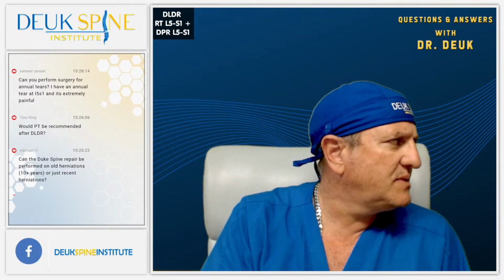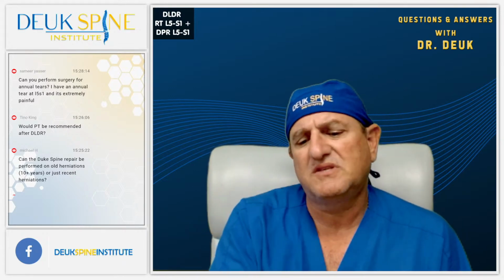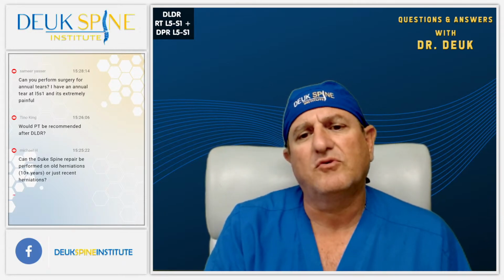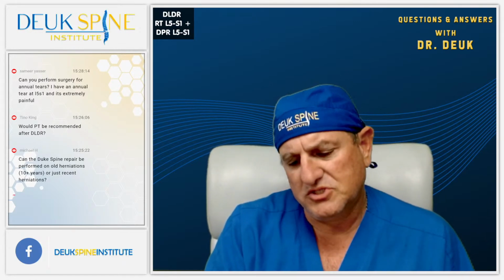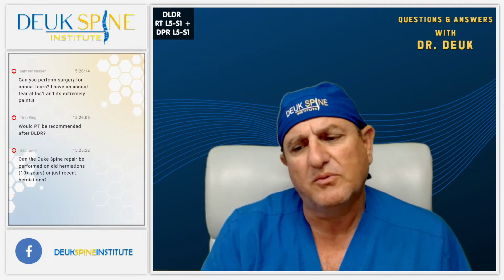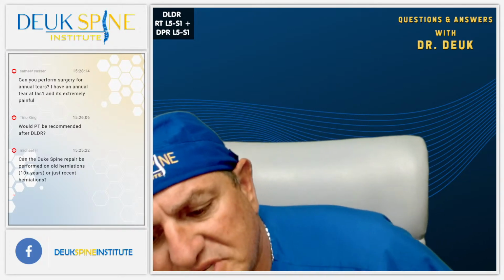Long story short, that's what we treated. We treated the disc, which was I think 8 out of 10, or 9 out of 10 pain for him. Plus, we fixed the facet joint, which was also very painful. So we did both during the surgery, and everything went well for him. So I'm very optimistic his pain will be gone. And hopefully we'll get a good testimonial from him tomorrow when we see him back.